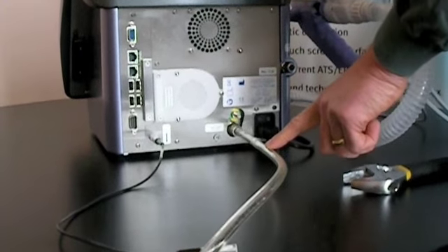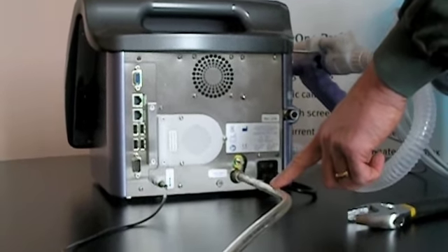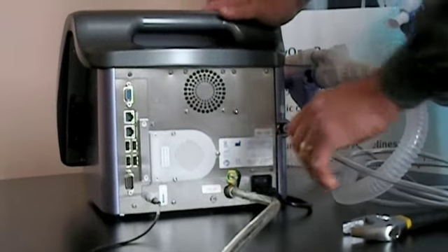We're going to connect the other side to the unit. If you need assistance connecting DLCO gas, please refer to our DLCO gas connection YouTube video. We'll connect it to this 8mm connector on the back panel.